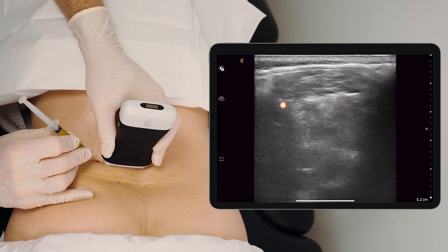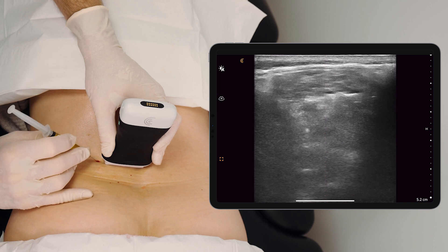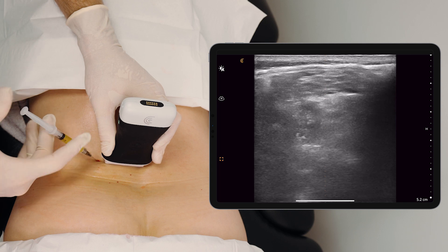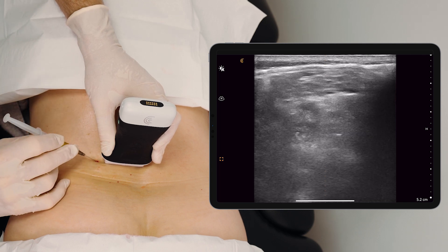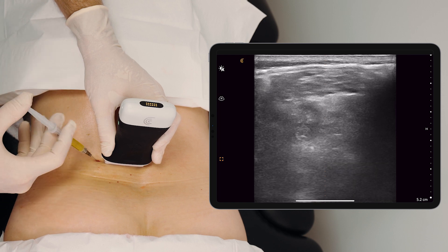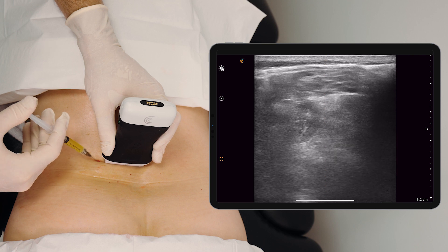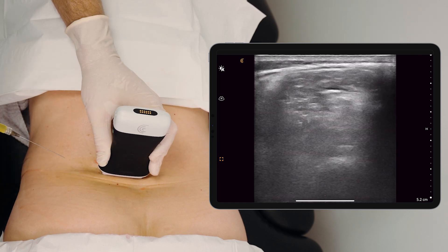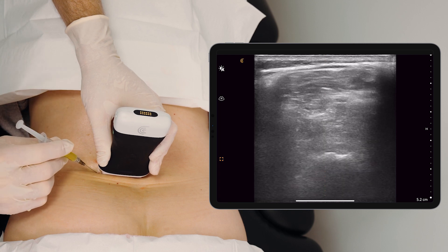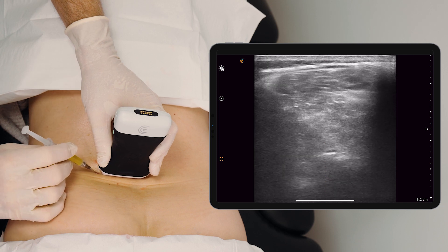We can very clearly see the needle in place. I can feel the needle touching the facet joint. I inject a small amount of the PRP and you can see it fill up on the screen. I make some small movements because with regenerative treatments like this, our goal is to fill up the ligaments around the facet joint and get some into the facet joint. Now we've got the needle at the L5-S1 facet joint capsule.